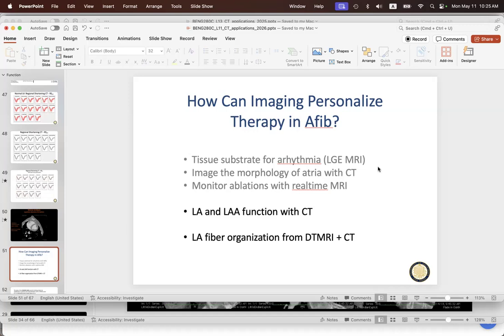And the other thing you can do with MR is, when a treatment for left atrial fibrillation is that you isolate the pulmonary veins by killing tissue in a circle around each pulmonary vein, with MR, you can actually see where you've made those burns.